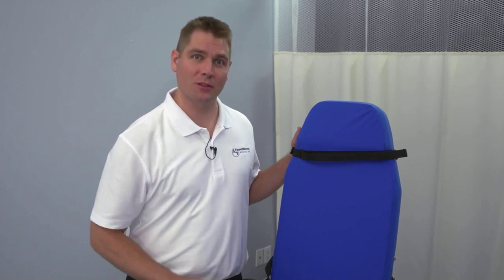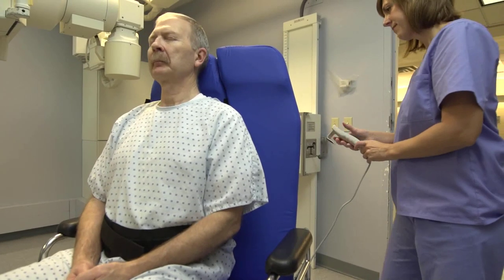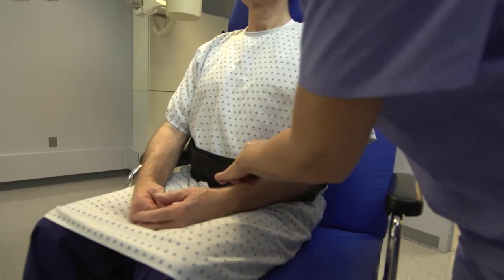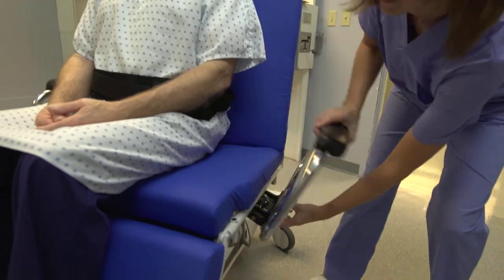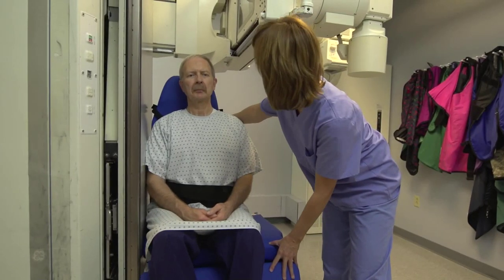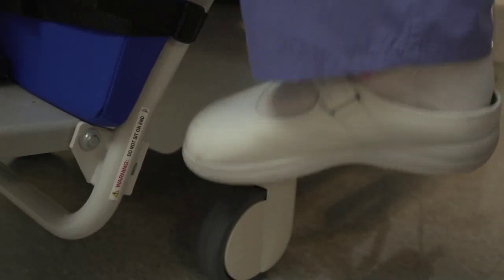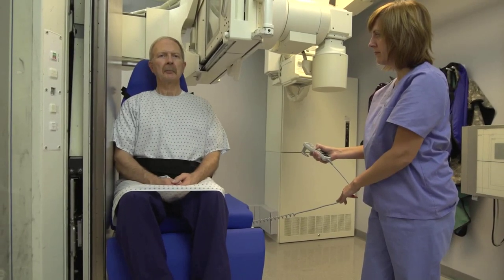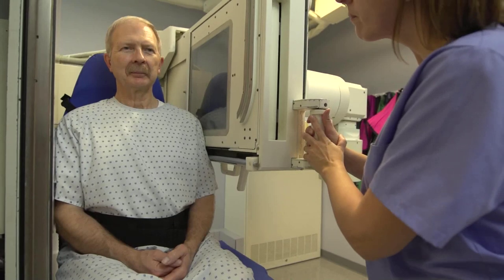Here's how it works. Make sure the patient is in the fully upright chair position and belts are secured. For the lateral view, lower the side rails and roll the chair into the RF tower. Lock the brakes. Use the pendant to position the patient to the appropriate height. Now you're ready for the lateral view.